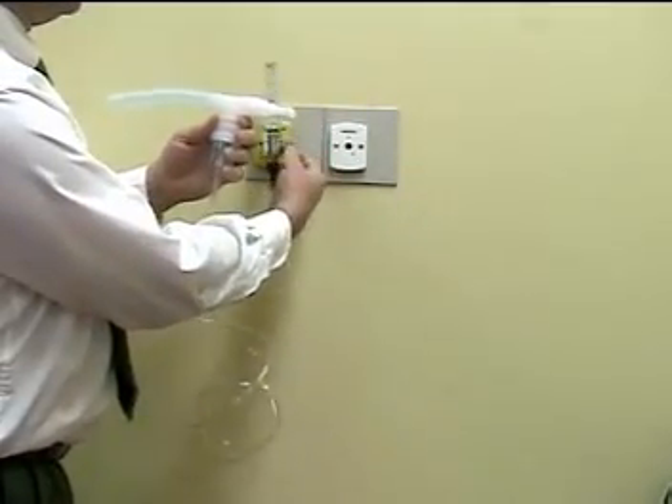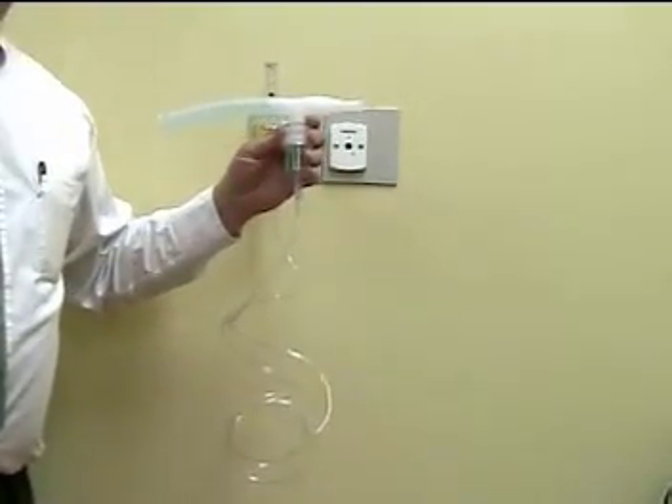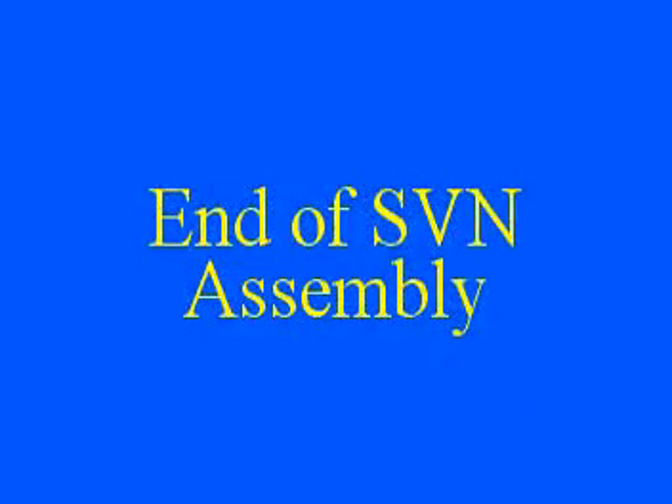Turn your flow on, typically to 6 liters per minute, and you'll notice that the mist will be coming out of the nebulizer.